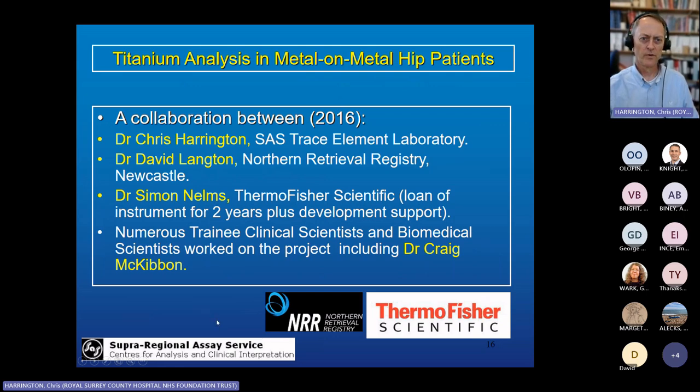Once I've gone through the last part of this, the second to last part of this collaboration was started in 2016, and that's when Dave from Northern Retrieval Registry came and said, well, we're interested in measuring titanium because we think there's something going on there with that stem that fits into the back of that ball. We think there's some wear going on there. Now, titanium's a pretty difficult metal to measure, as it turns out.